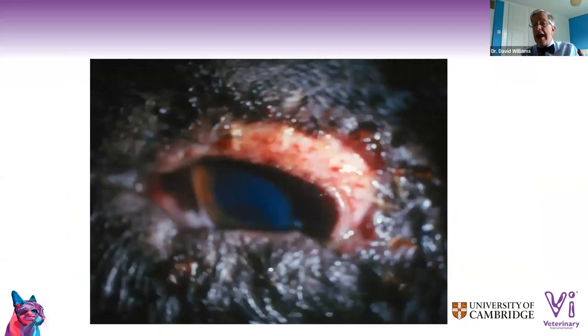The moment you've done the surgery, A, you've changed the colour of the dog's skin. That's not something I do on a regular basis. But here, just a picture from another dog. Sorry, I couldn't find the picture from that dog. But you can see here now, it looks just horrendous, because you've got this big pink strip of subcutis, in a week or so, that will have all granulated up. And this is a granulation technique here, so that you're left with a dog with a lovely hairless edge to its upper eyelid, and in so much more comfort than it was when it had all those hairs rubbing on it.